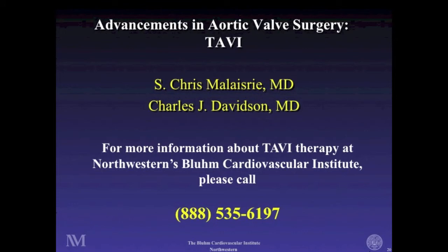So what can we do? Again, this is first-generation technology. What are the things that we can do to improve on this, which I think for most of us feels like one of the most important complications that we want to get better with? There's probably 3 things that are going on that are trying to address this. One is the lower profile catheters that will help in delivering the device across the native valve and potentially preventing any of the debris from either the aorta or the native valve being broken off during the procedure.